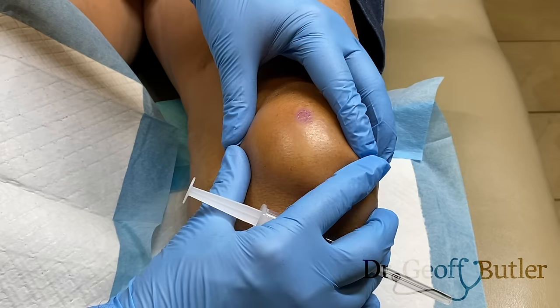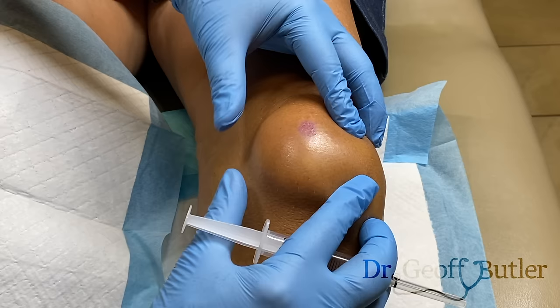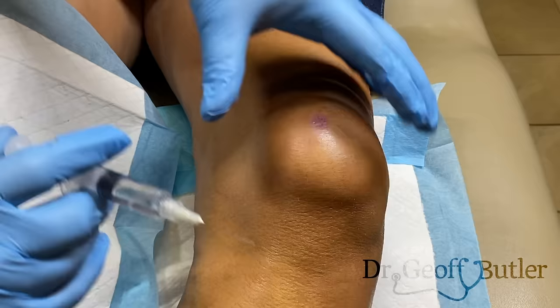This patient was subjected to a trauma approximately a month ago and she has a significant effusion that's still there — it's just not settling down and is causing some intermittent discomfort. Normally I'd leave this alone for a week or two to see if it starts to settle, but because it's taking so long and she's having trouble with it, we're going to drain it and send a sample out to make sure everything is clean.